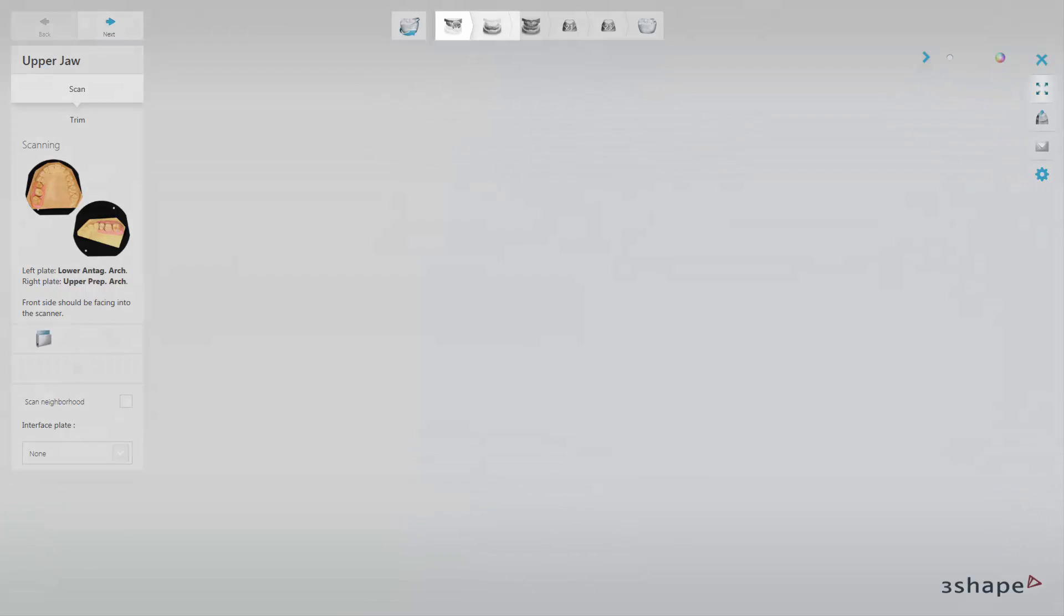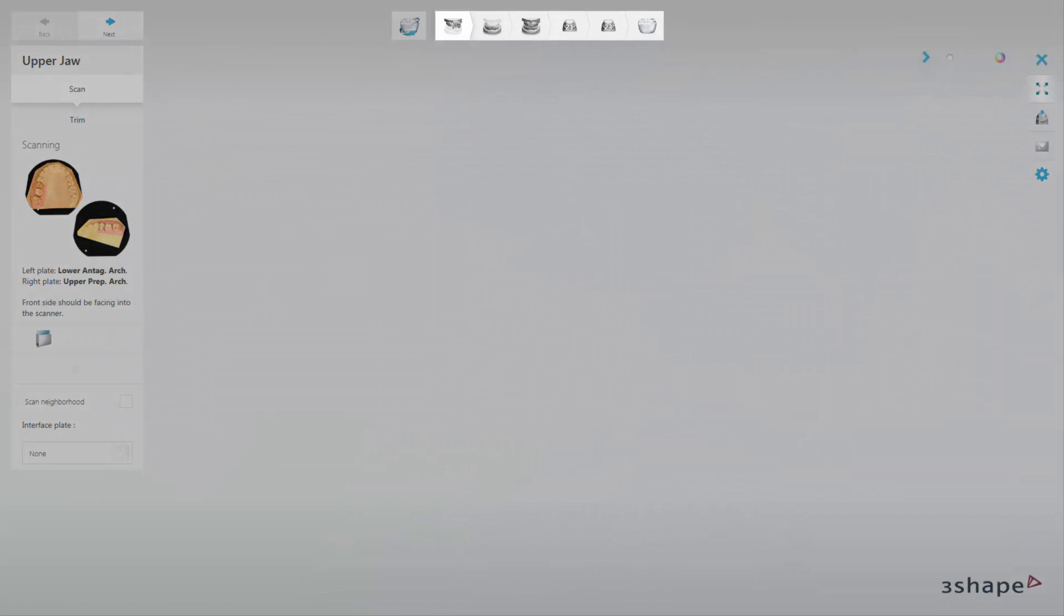At the top of the user interface window, you will find the workflow bar showing the scanning steps. You're able to freely switch between the completed steps. The length of the top workflow bar may differ depending on the case.